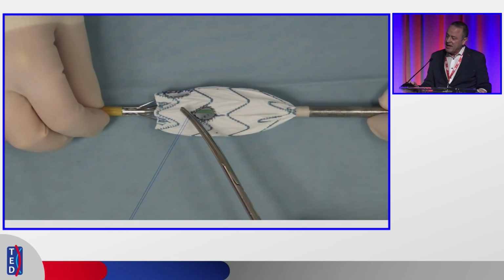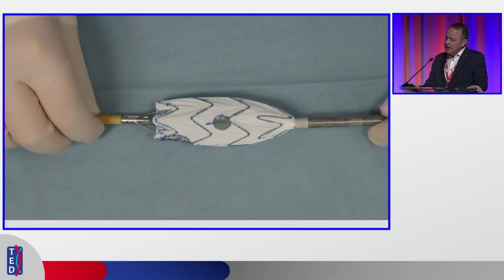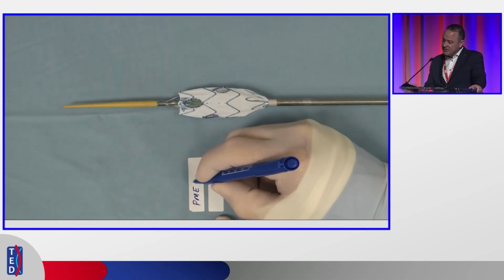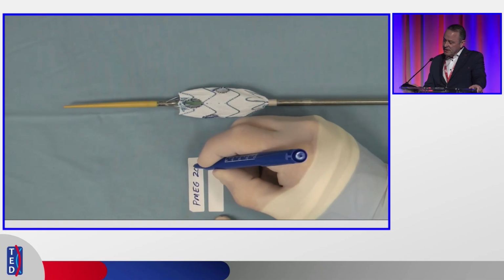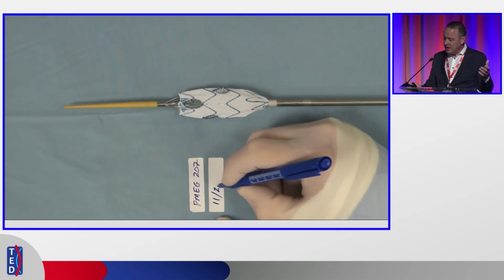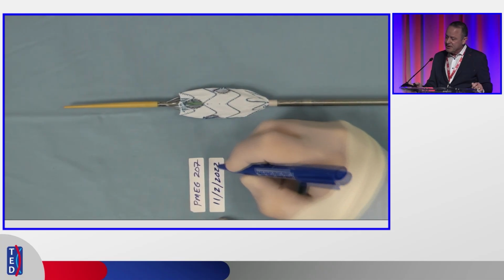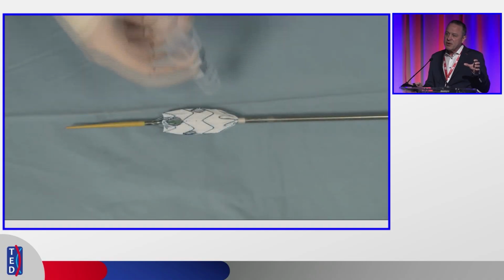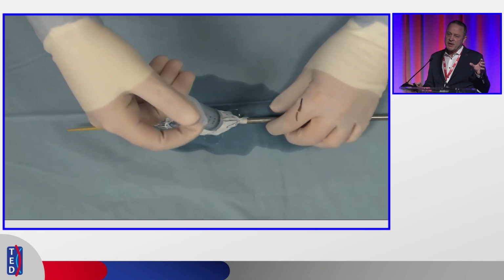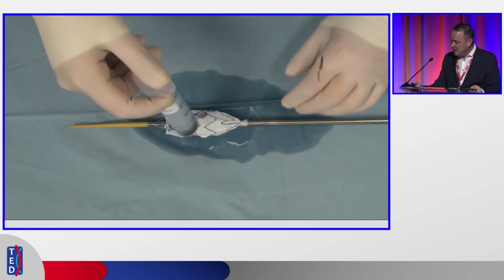After we created our 3-vessel modified graft, I believe this was done back in 2022, if I'm correct, we reload this graft using specific tools. During the lunch symposium tomorrow, I'm going to show you some of the reloading tools that we have now that can standardize this technique.